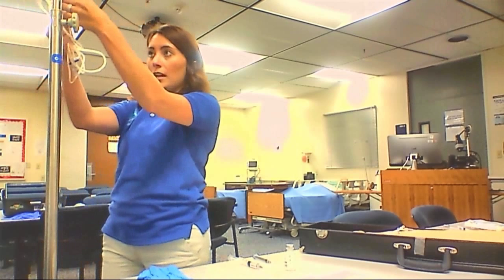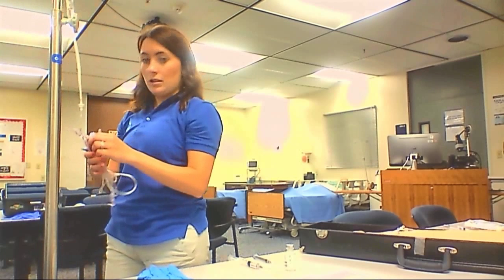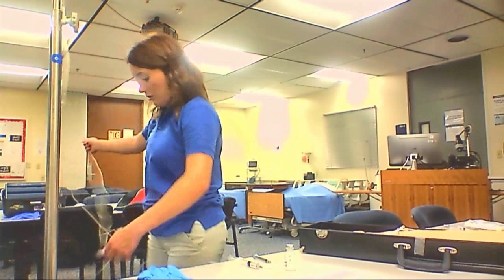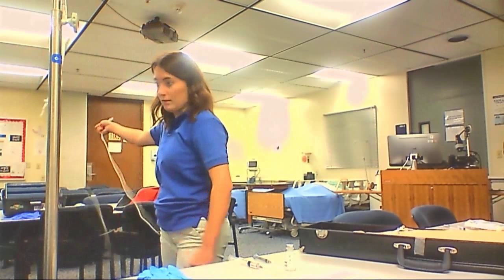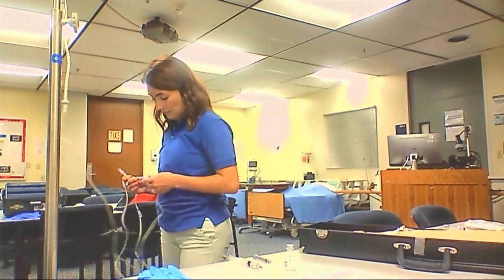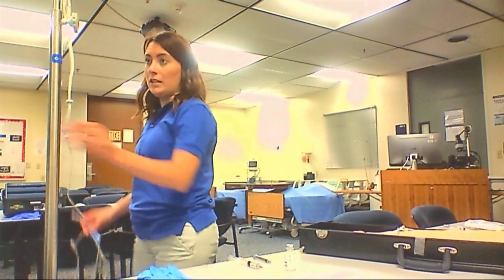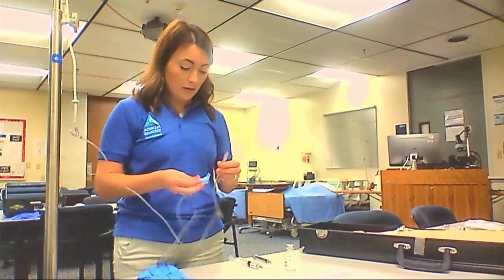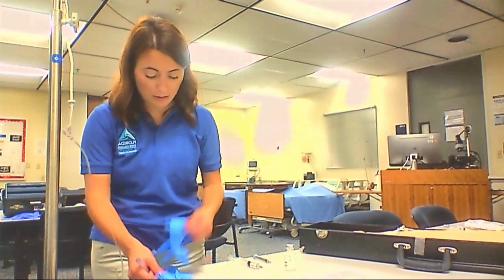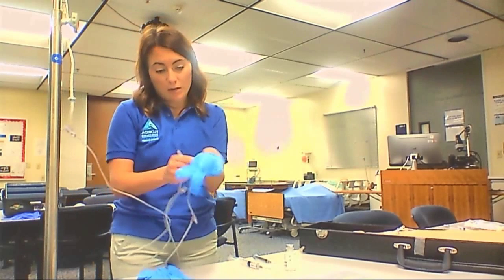I also want to prime, filling the chamber half full with the fluid, unclamping my IV to make sure that the tubing is free of obstructions, which in this case it is. So we can begin the rest of the procedure. I'm going to put some gloves on, which I should have done previously, so I apologize about that. I have already washed my hands.